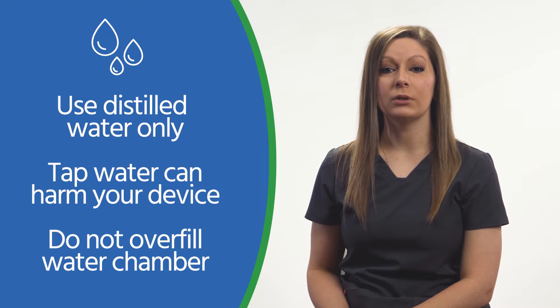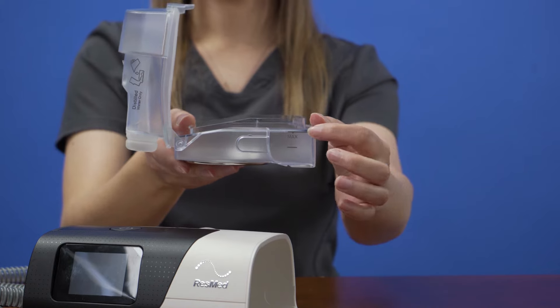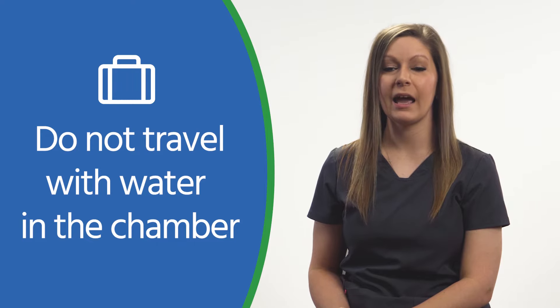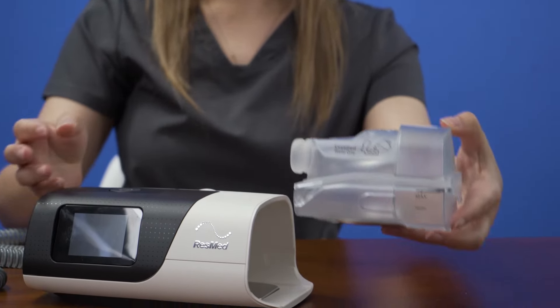Pull up on the tab to open the water chamber, then fill it with distilled water. Use distilled water only, as tap or drinking water contain mineral deposits that can harm your device. Be sure not to overfill — there is a fill line that you should not go over. Do not travel with water in the chamber, as this can cause water to go into the machine and cause damage. Once the chamber is filled, you can close the lid and slide the chamber back into the device.